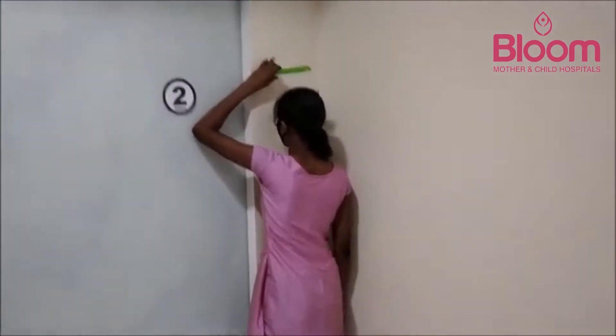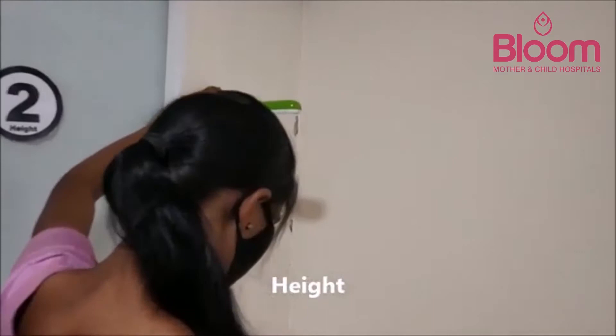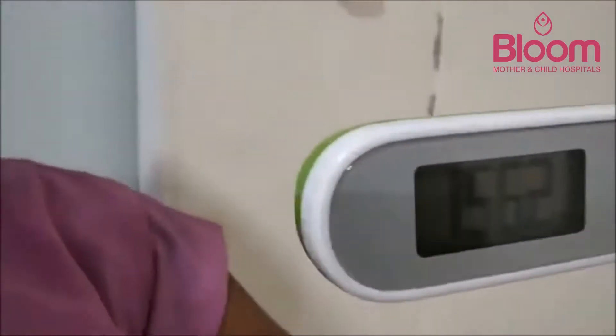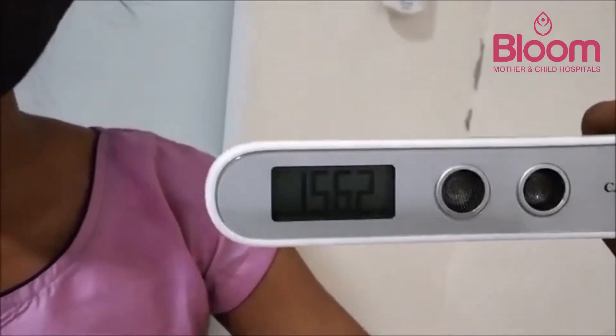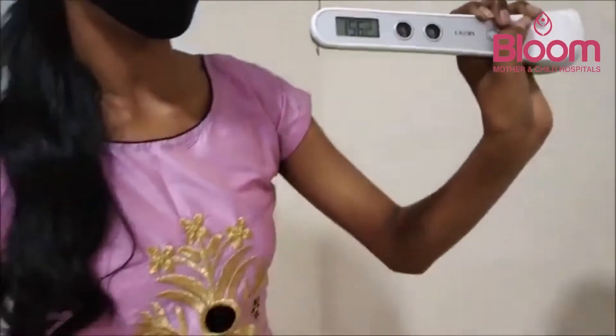The patient has moved to station two and is using the digital stadiometer to measure their height. The reading comes in at 156.2 centimeters.